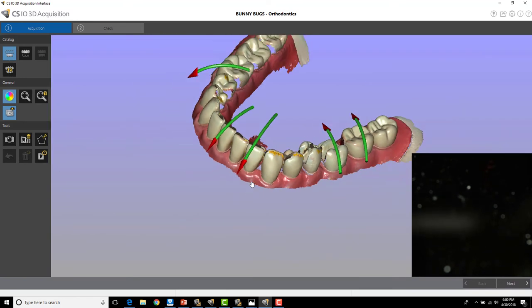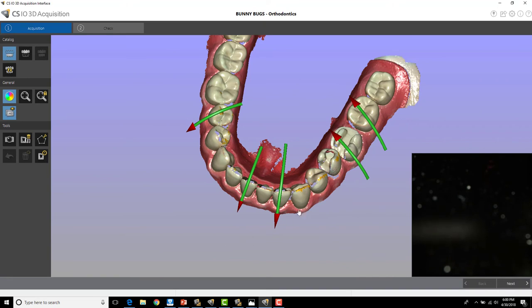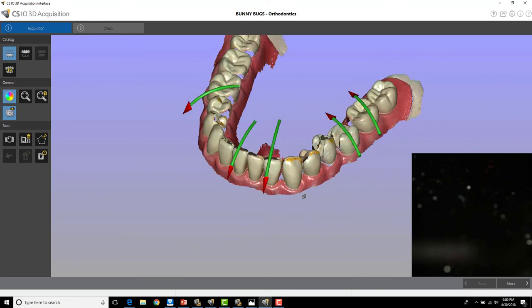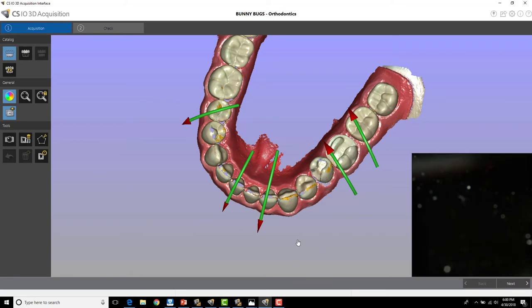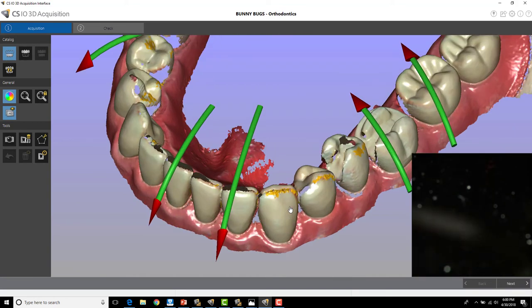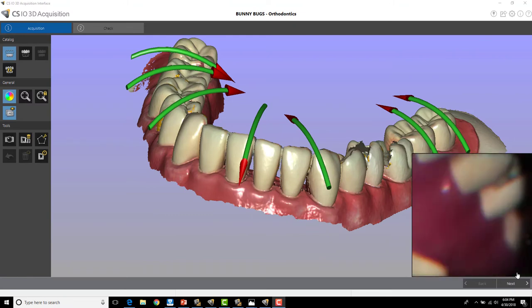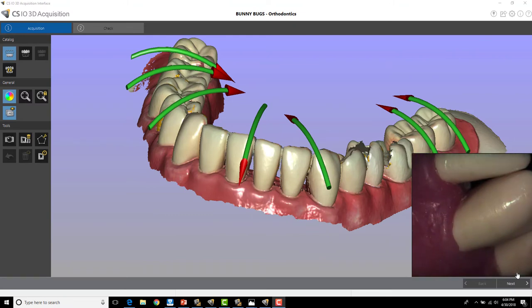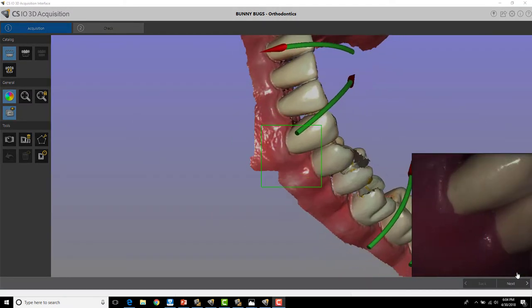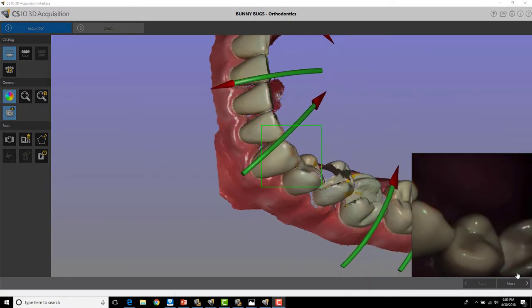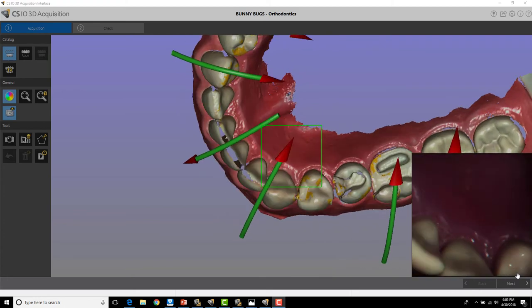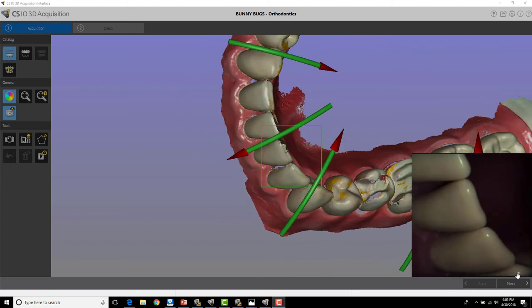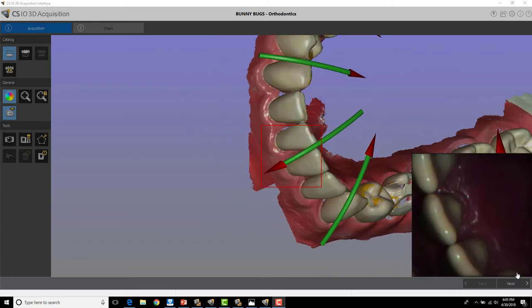In addition to that, you're getting a ton more of these green arrows, which signifies that you need more data in that area. They get in the way and you have to correct them if it's important to the scan. Now you can roll the scanner over in the direction of those arrows or just roll over from buckle to lingual in those spots.